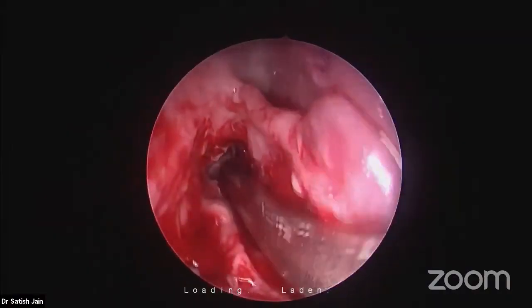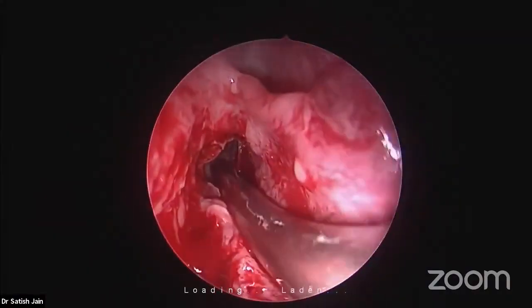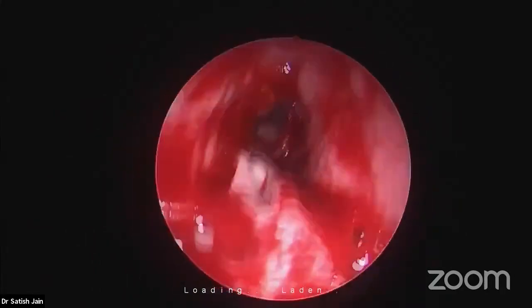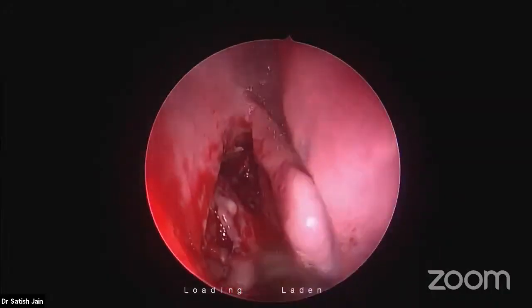This is articulated punch. For residents' sake also, if you could say how suprabullar recess can be differentiated from a frontal recess. Definitely, I will show you now.